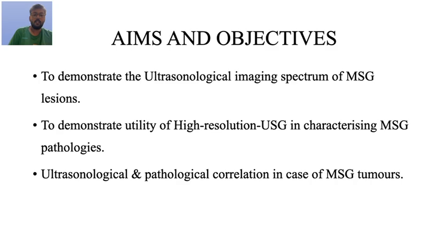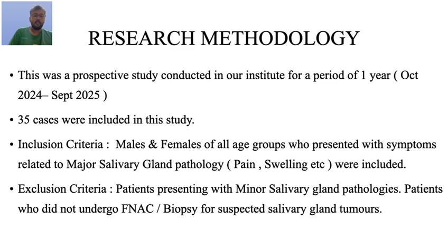Aims and objectives: to demonstrate the ultrasonological imaging spectrum of major salivary gland lesions, to demonstrate utility of high resolution ultrasonography in characterizing the major salivary gland pathologies, and ultrasonological and pathological correlation in case of major salivary gland tumors.